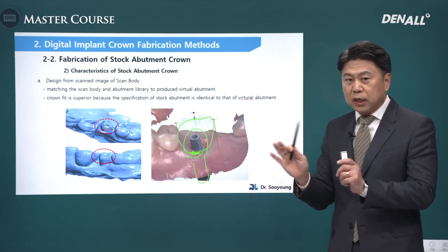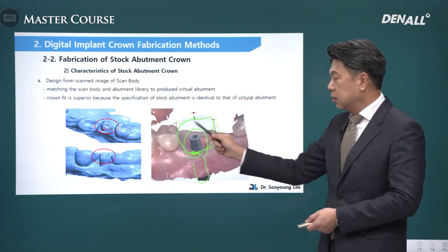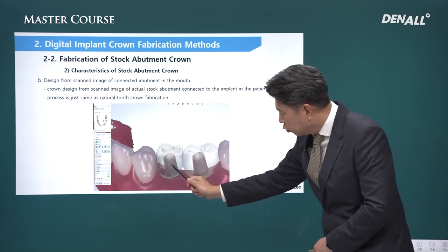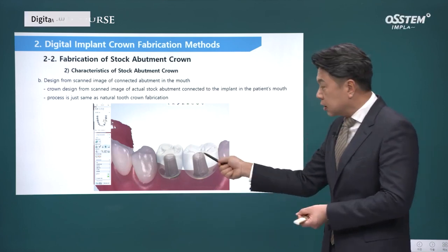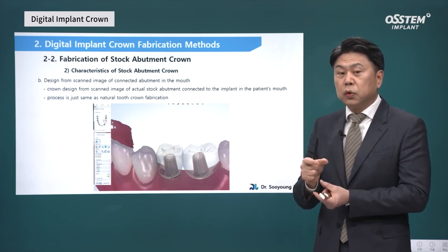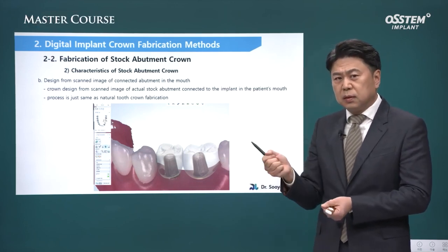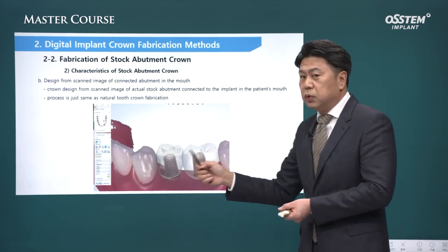Of course, there are differences between custom abutments and stock abutments, but the digital process here is the same between the two. The impression was taken directly in the mouth. It looks irregular because when we scanned it, the titanium metal transfer abutment connected in the mouth was reflecting light, so it is not easy to take an impression using an intraoral scanner because of the light reflection.